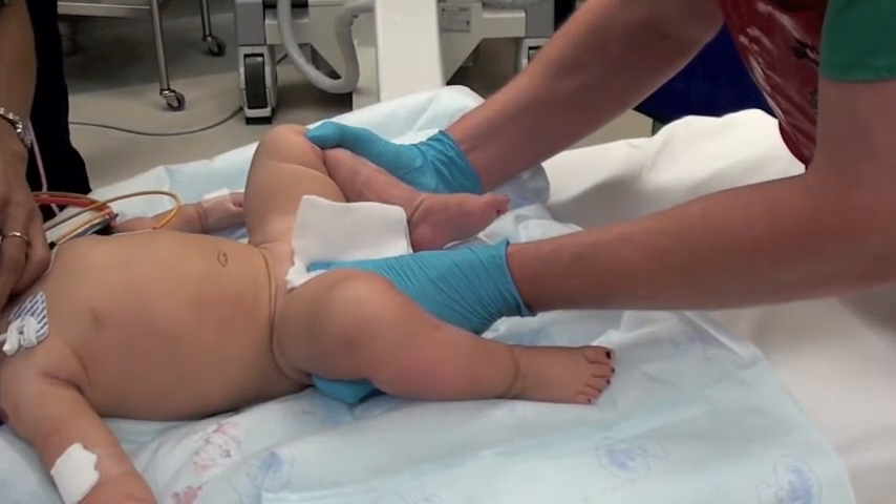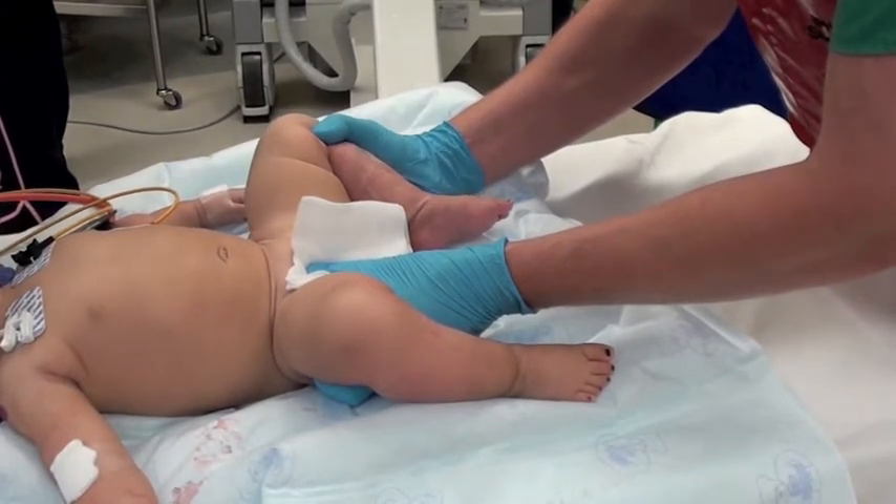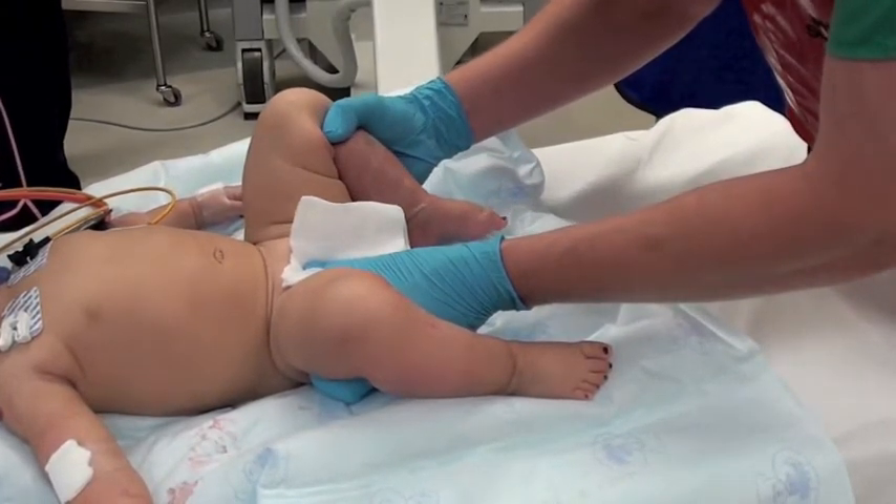Now you'll see the hip go back out of joint. Again, these ligaments are much more loose under anesthesia and the muscles are more loose.